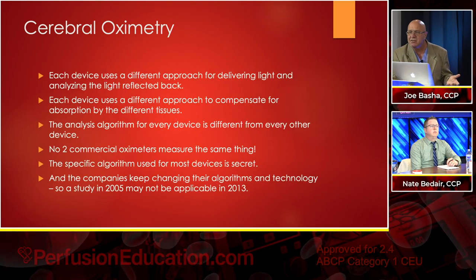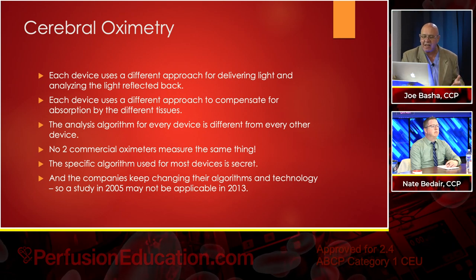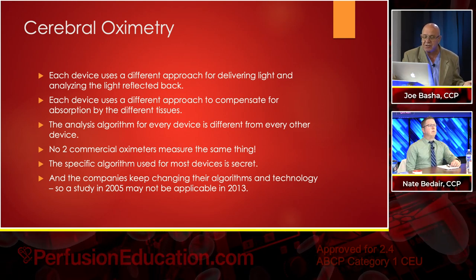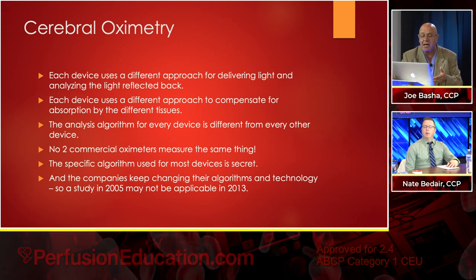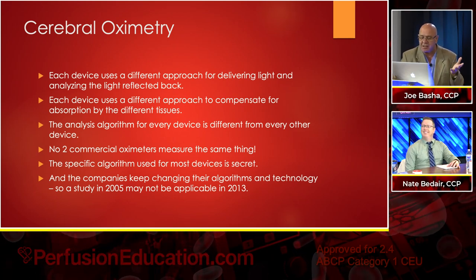Each device uses a different approach for delivering light and analyzing the reflection of the light back to it. Each device uses a different approach to compensate for absorption by the different tissues. That's absorption of the light, right? We just got through talking, or it's actually absorption, yeah. Not adsorption. Now I'm stuck on adsorption. Absorption, it absorbs the light.